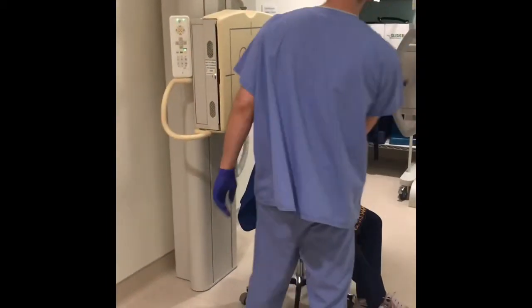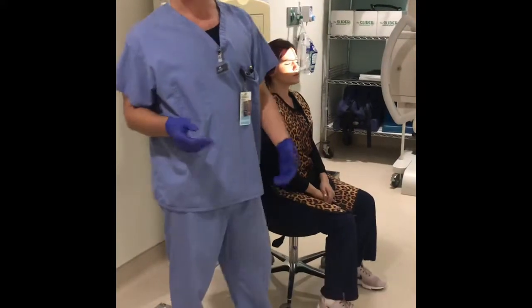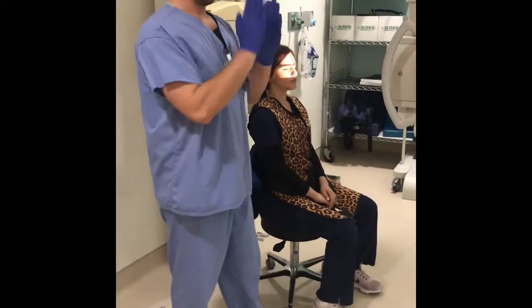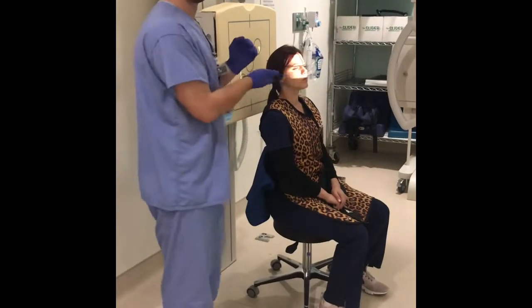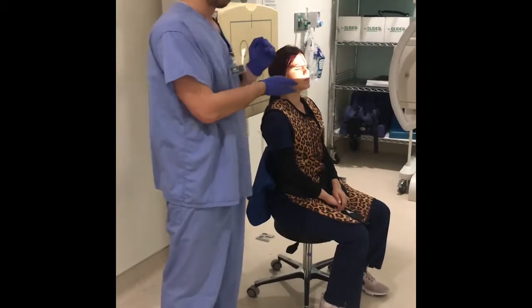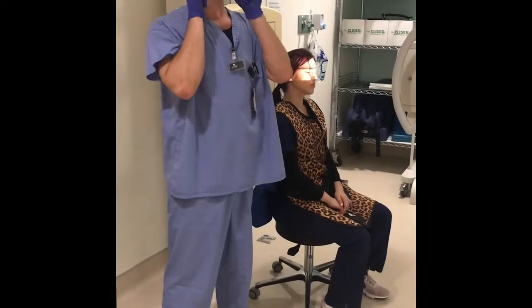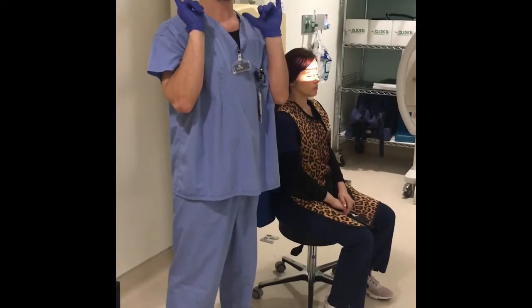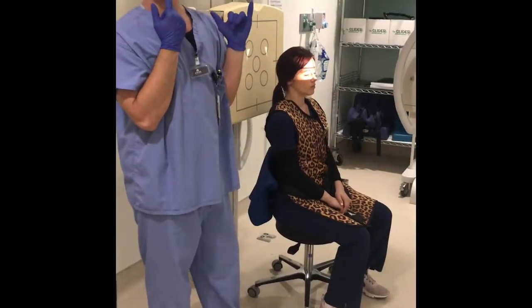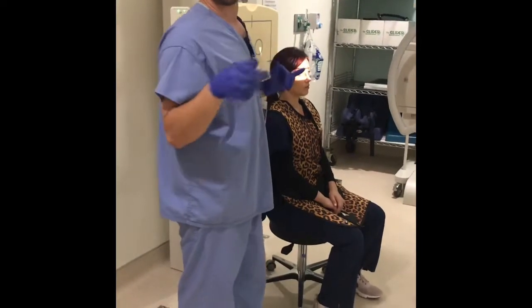Okay, close your eyes. I don't want to blind you. So the next one is the SMV. Our goal is to get our IOML parallel to the IR, and we still have a completely horizontal central ray, and we want the mid-sagittal plane also to be perpendicular. Both gonions are supposed to be equidistant, so there's not going to be much rotation of the head. We want the mental point to superimpose the frontal bone.